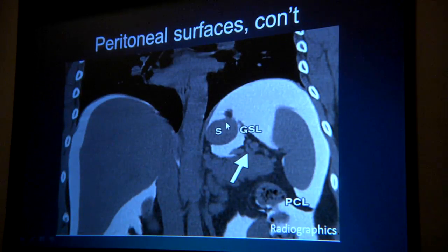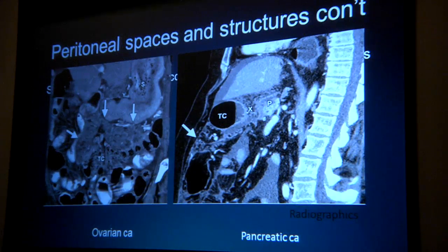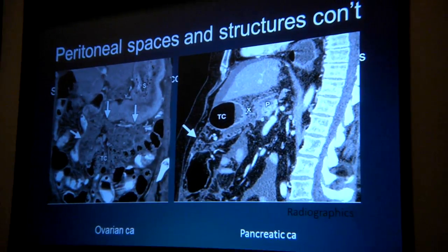This is a coronal CT scan, and I only show it to you because it actually demonstrates that these structures really do exist. This is the liver, the spleen. This would be the left subphrenic space. Of course, it's greatly exaggerated because the fluid has filled them up. The right subphrenic space, bare area of the liver here, Morrison's pouch, the phrenicocolic ligament, and the gastrosplenic ligament. And like I said, in the normal person, you may not see those structures directly, but when disease happens, that's when we really kick into high gear in an attempt to describe to the surgeon where the disease is.